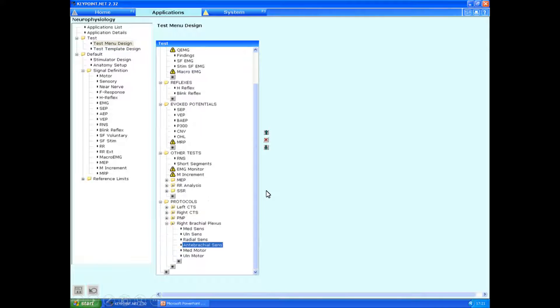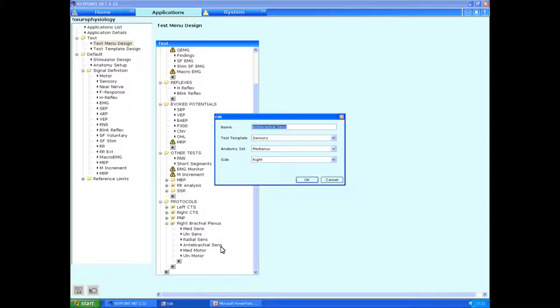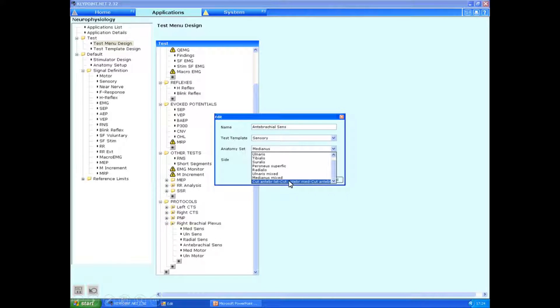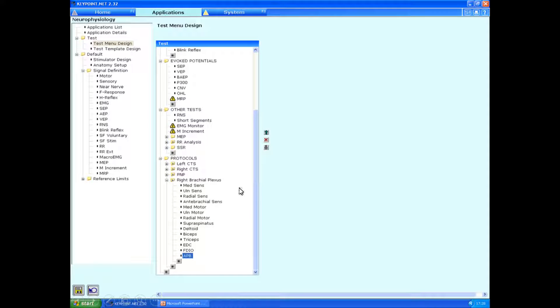And we can go back to test menu design. Back to our right brachial plexus set. Let's say click on the antibrachial sensory. Previously, I didn't have this loaded up as the anatomy set. So I can now click down on the anatomy set, and you can see that the antibrachial cutaneous responses are now here. And those have been updated.